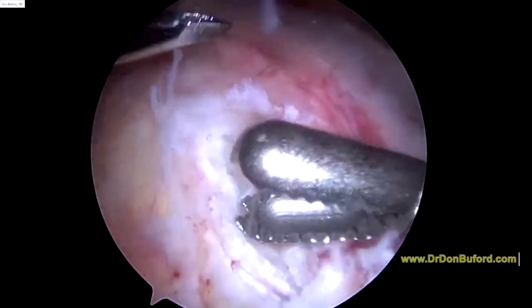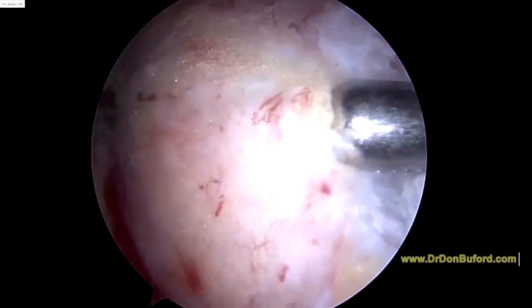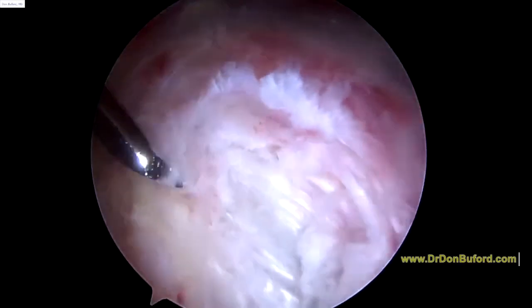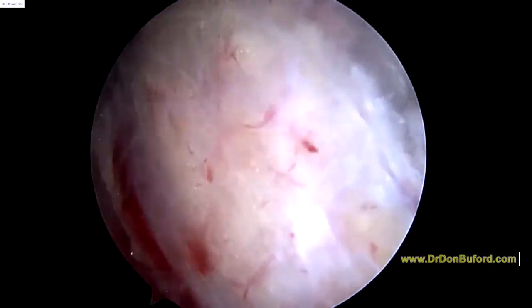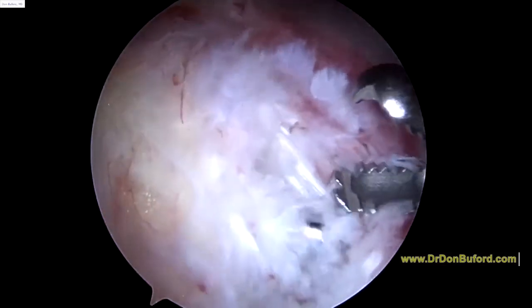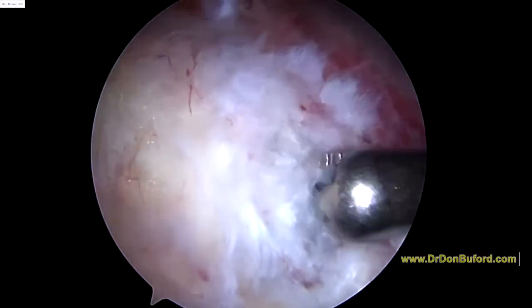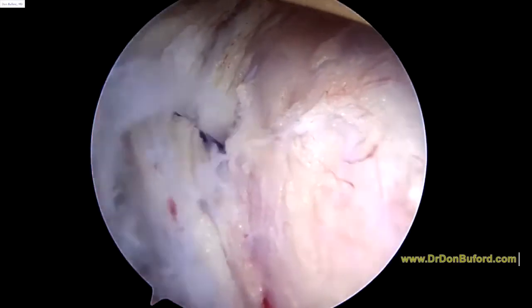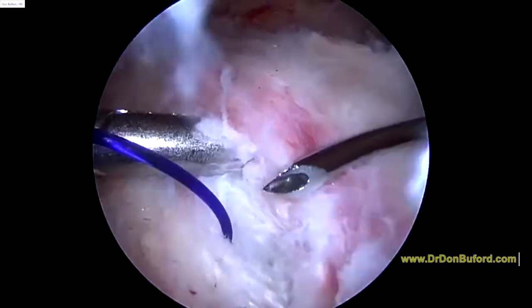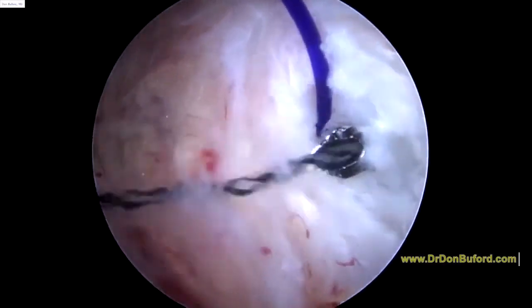Here's our suture hook. We're going to come in here and put it right there. You see you've got that suture going across — you only want to cross half of the tear. We're going to go through the other half now. We're going to bring the stitch this way, starting back about here. This is our second pass — you can see the tip coming out right there. We get to work and pass that.